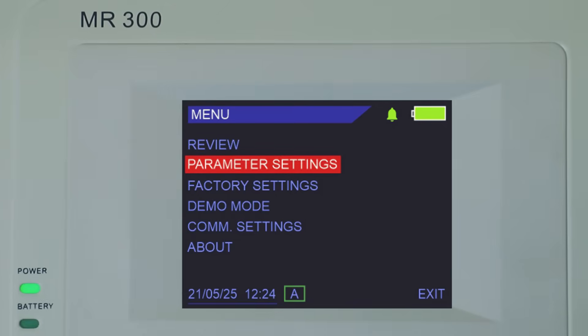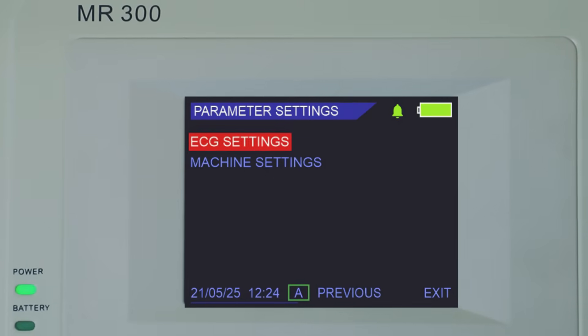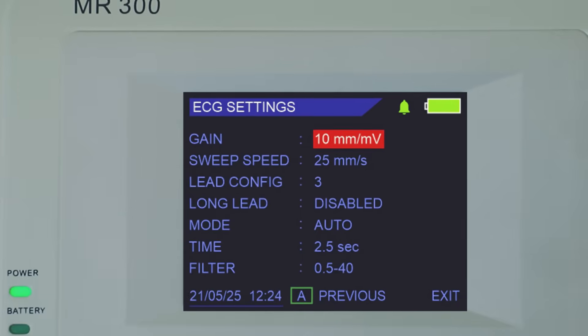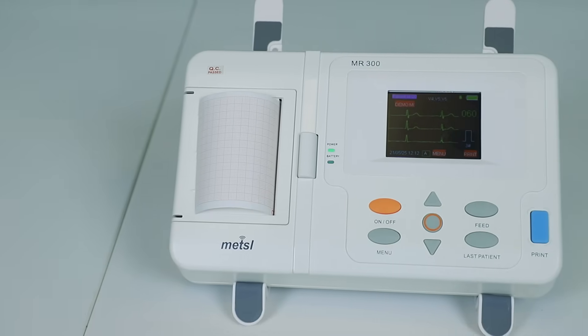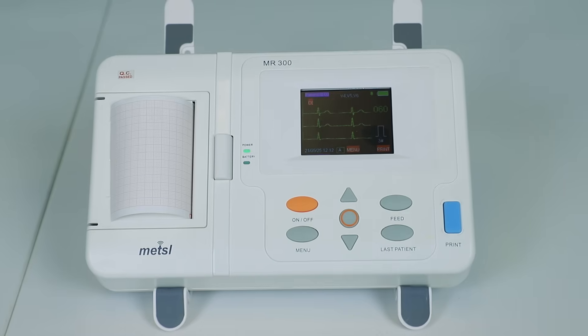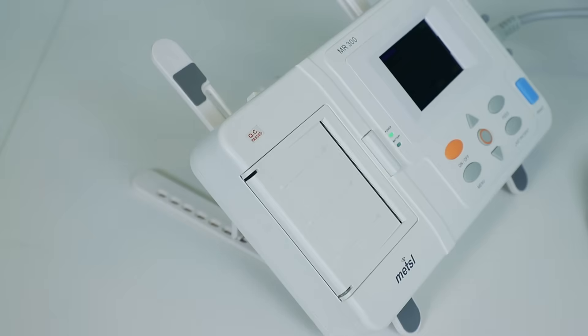The intuitive menu allows you to easily navigate and customize various settings. From lead configuration to filter adjustments and patient information input, the Maestro MR300 Mini Machine offers flexibility to tailor its performance to your specific needs and preferences.